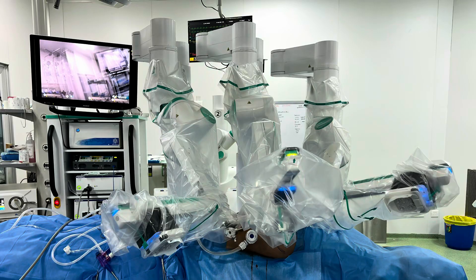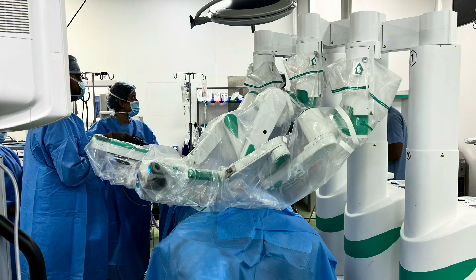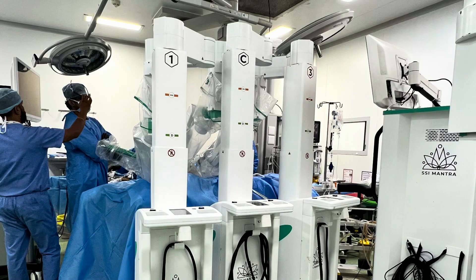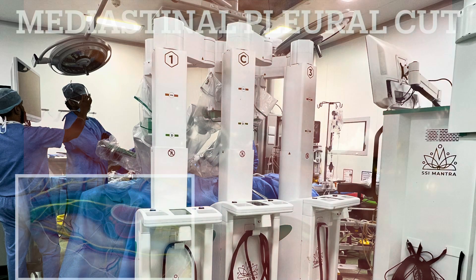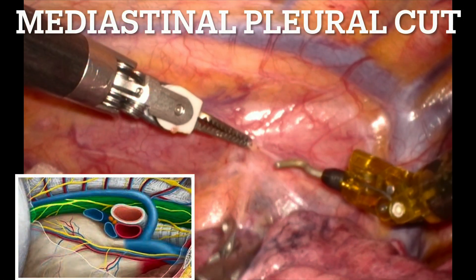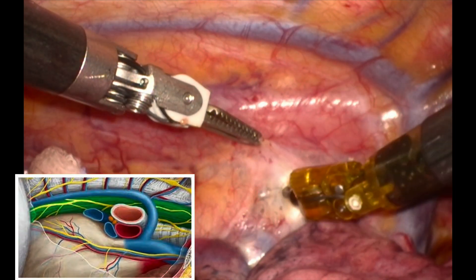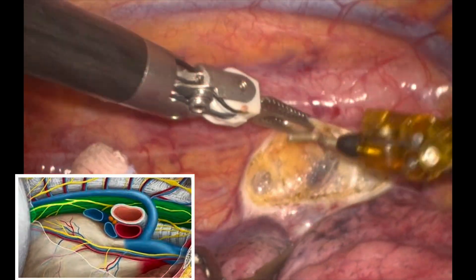Once the ports are placed, the robot is docked from the left side. This is the position of the robot after docking. You can see the vision cart and all the arms, which are far enough apart to avoid any external clashings. We start with division of the mediastinal pleura below the azygos vein near the lung.